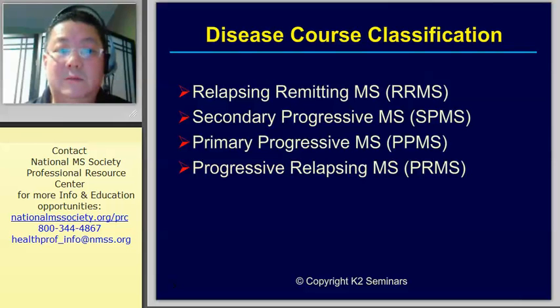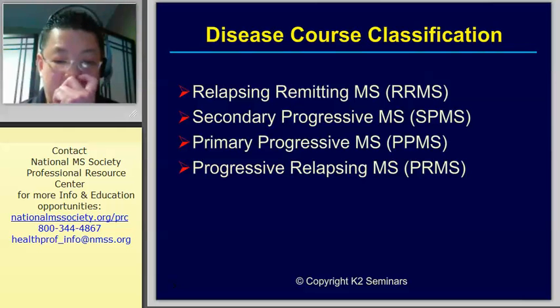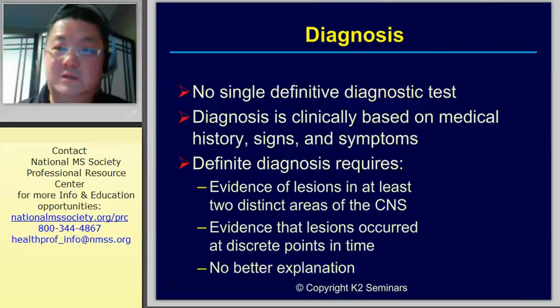I'm backtracking a little bit so you understand when to provide that input as far as the electrical stimulation is concerned. So remember, we've got several different kinds of diagnoses, and so when can you actually treat? It really does not matter in which diagnosis you end up treating the patient. My plea to you is that you start as early as possible, only because you'll see.